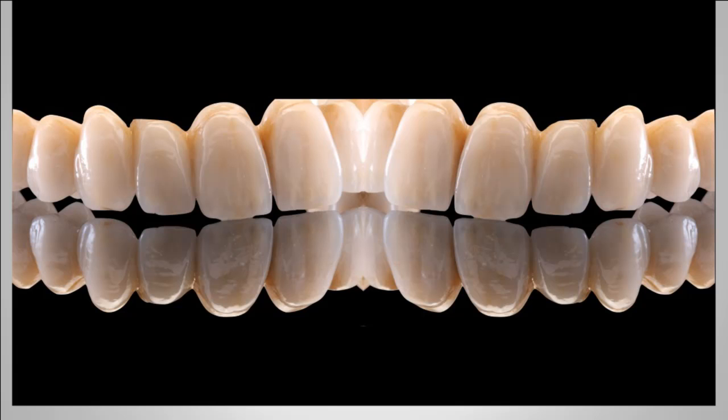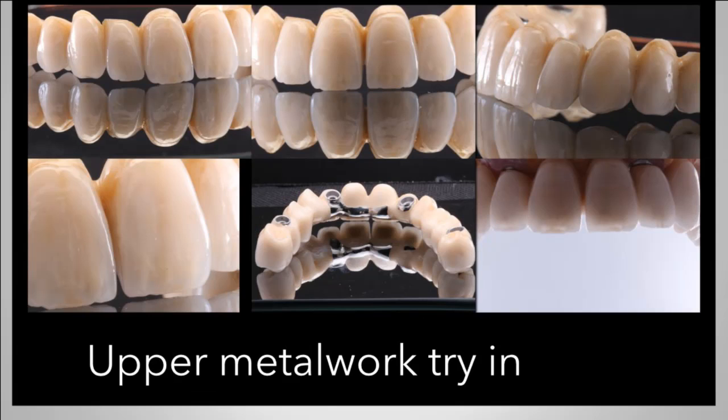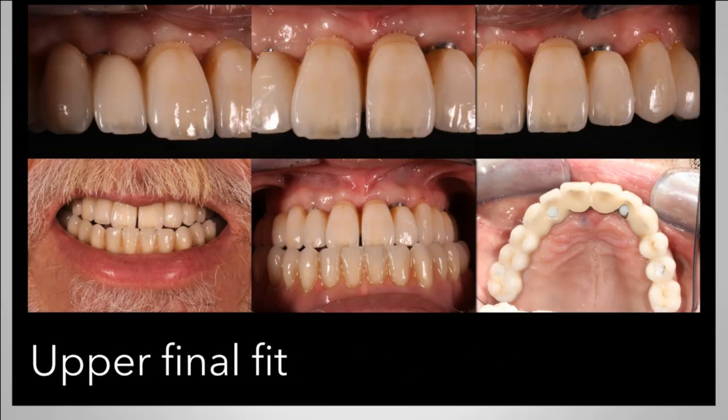And what you can see here is a higher end solution where we have used porcelain as the final restoration. So in terms of budget, that's a much higher and much more expensive option. And with the porcelain in place, what we've been able to do is to achieve a nice result for the patient that looks like this. So this is the final result for the patient.